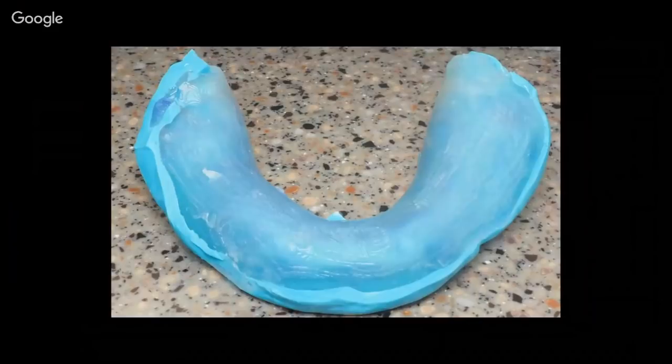Now, going back to my first case, where I took their denture and just added wax right over the top of it, I would do the exact same thing for a patient where we didn't have a denture. Once I've done that impression, I'm going to take a burr, cut off the handle of that impression tray, cut back all the excess PVS, and turn this into a chairside bite rim.